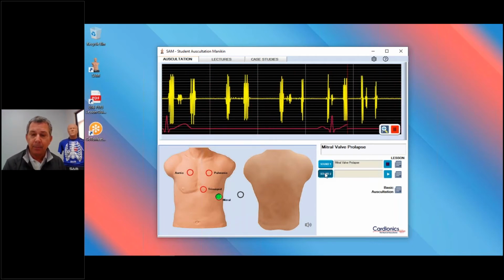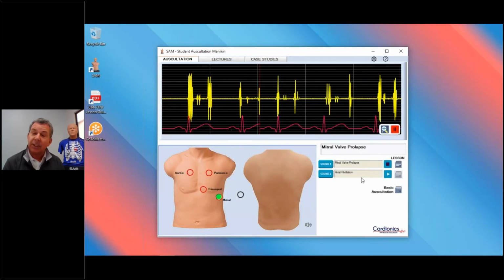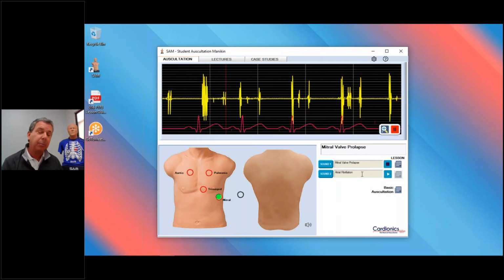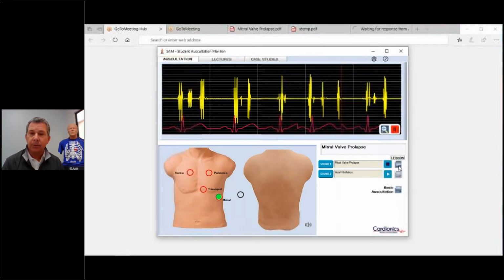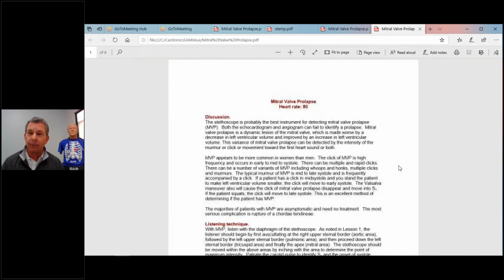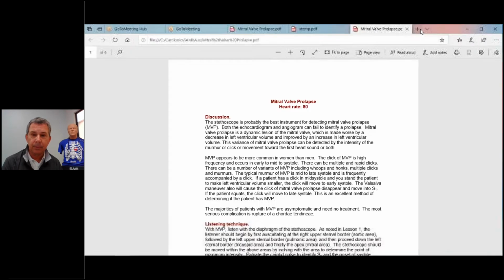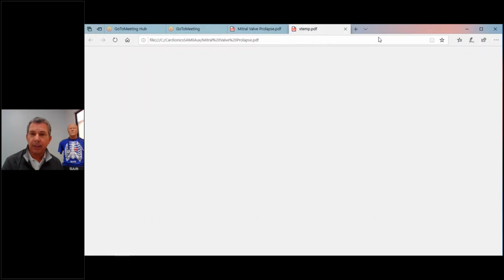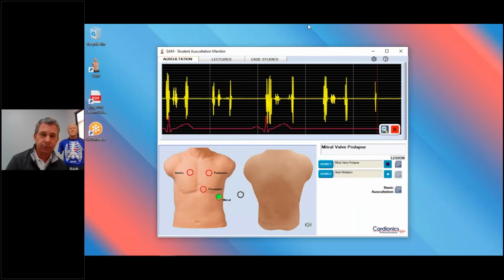If I wanted to cue up a second sound, let's say AFib, for example, I could double click on that, and that's on cue, ready to play when you're ready. Each of the sounds also has a corresponding lesson. So I'll double click on that. And you can see it's going to bring up a mitral valve prolapse lesson, discussion, listening techniques, just some great detail for you and your students. I'm going to close out of that. And let's move on to lectures.